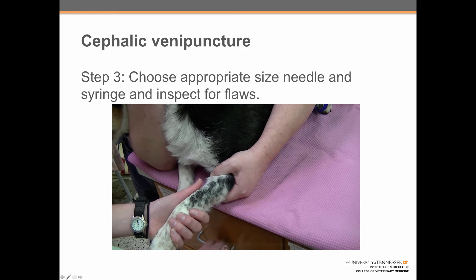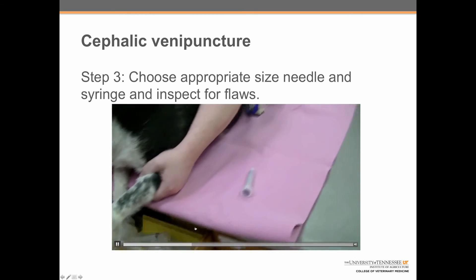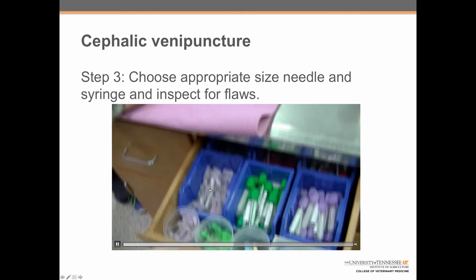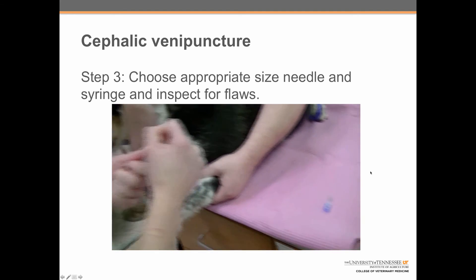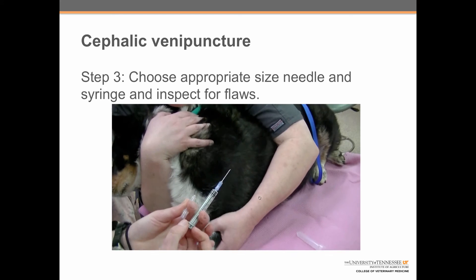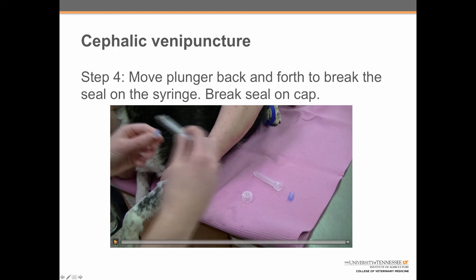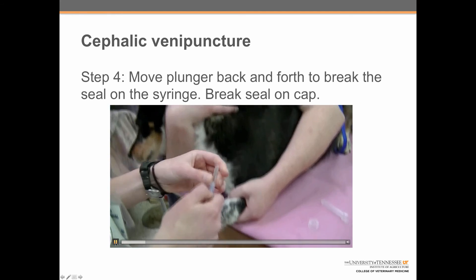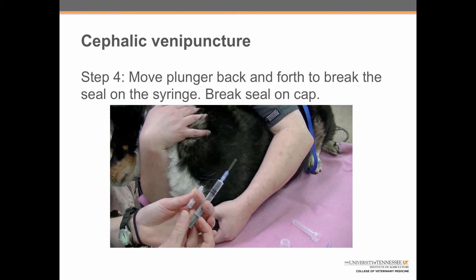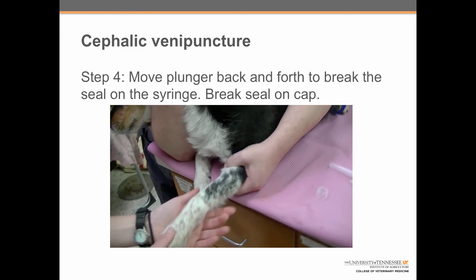Step three: choose an appropriate size needle and syringe for the vessel and inspect for flaws. For most dogs, the appropriate syringe is a 3cc syringe, and the needle would be either a 22 or 20 gauge — a 22 gauge is probably the better choice. She's assembling the syringe and needle and inspecting carefully for any defects. Step four: move the plunger back and forth to break the seal on the syringe. Failure to do this can cause an extreme influx of pressure when pulling back the plunger, causing blowing of the vein. She also breaks the seal on the cap to make it easier to remove when ready.